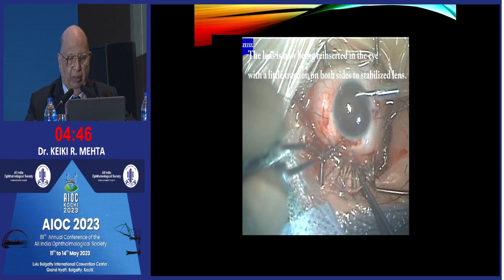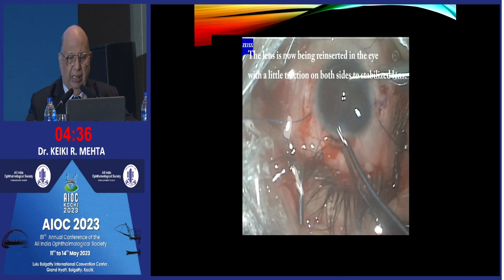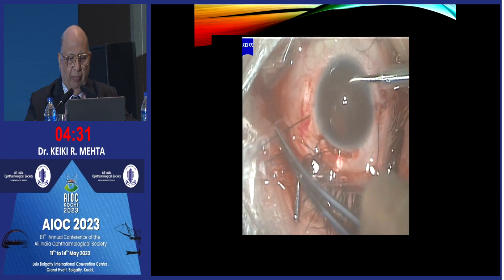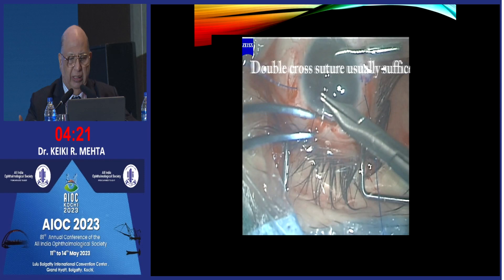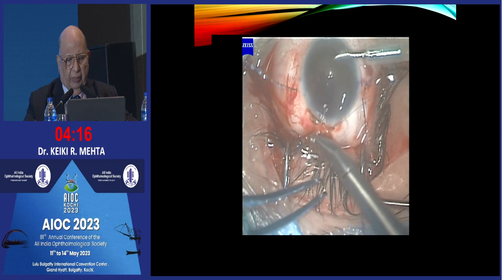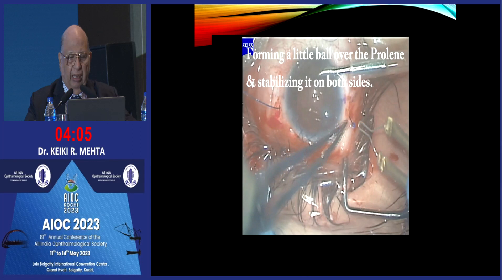Then all you have to do is insert it in a manner where the lens lies posterior, and insert your lens inside. No gymnastics, nothing being done inside the eye — no hand over hand, fist over fist, no twirling of the lens. You simply put the lens and as you apply a little traction at the sides the lens will suture into position. The same rules apply: you open the eye, close the eye first — always do this as a regular routine.